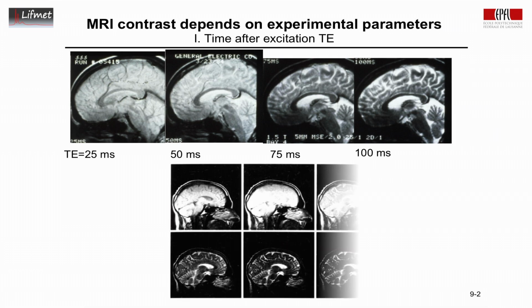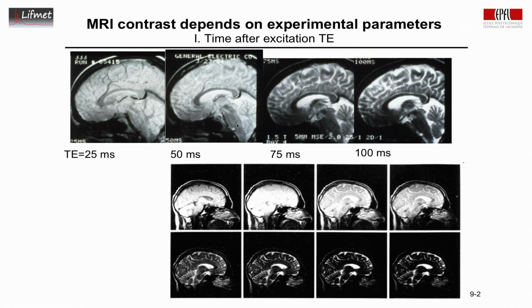Here's another example of images. As this parameter, time after excitation, is increased, from very short to very long, here we can only see the fluid filled spaces in the brain.